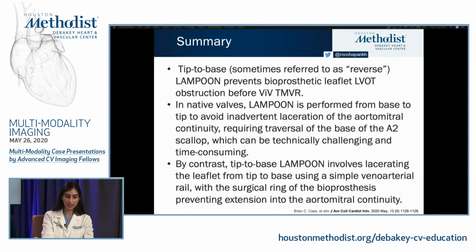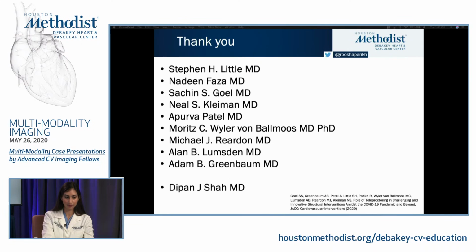By contrast, the tip-to-base LAMPOON involves lacerating the leaflet from the tip to the base using a simple veno-arterial rail, with the surgical ring of the bioprosthesis preventing the extension into the aortomitral continuity.